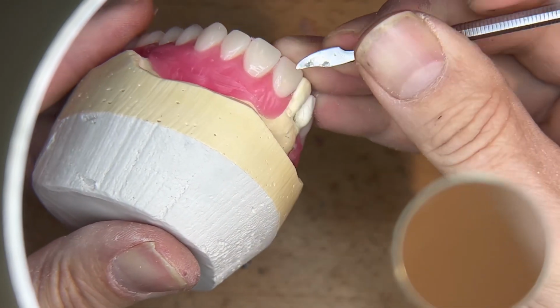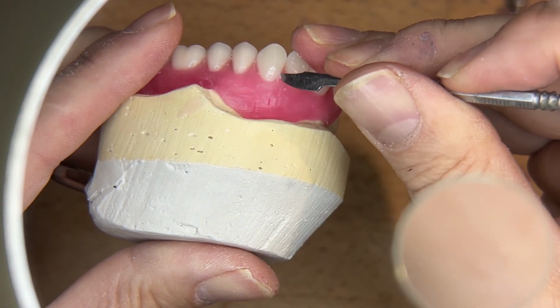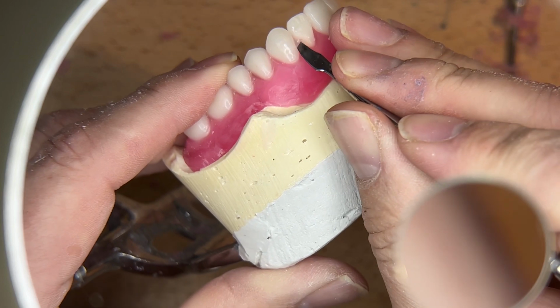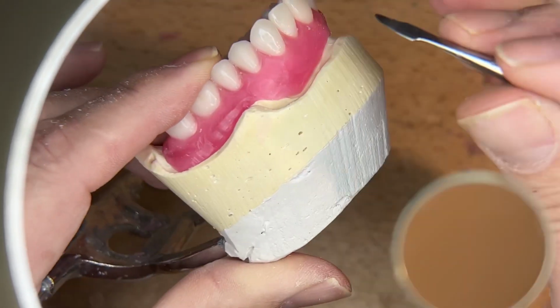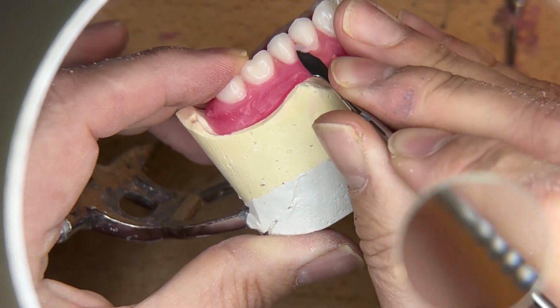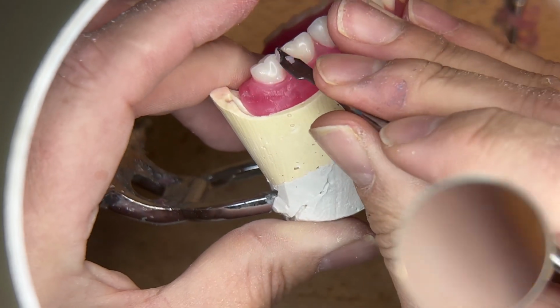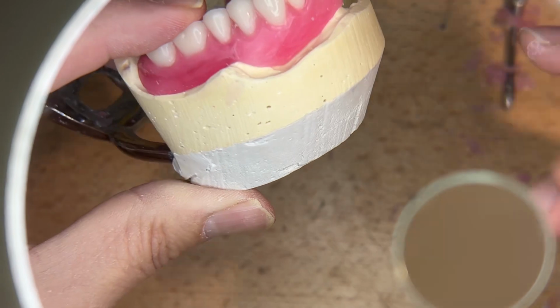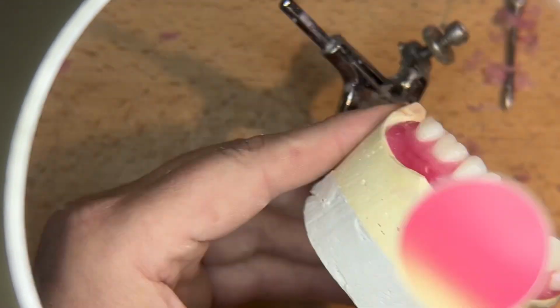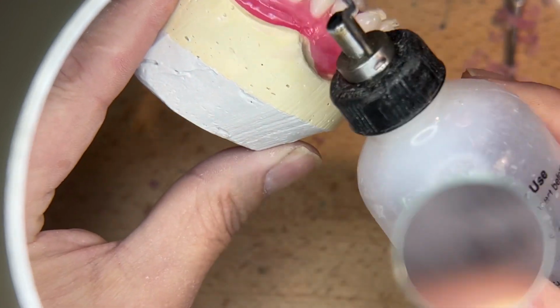I can go in here and clean up any wax that I may have, or I can redefine some of these marginal ridges and gingival margins. As I was going through with the first carver, I just did it in one fell swoop, and here we can get a little bit more detailed. Probably something I would reserve more for the final wax-up, but while we're here, it was hard to leave it alone. A little bit of alcohol torch just at the edge here. Smooth that off.